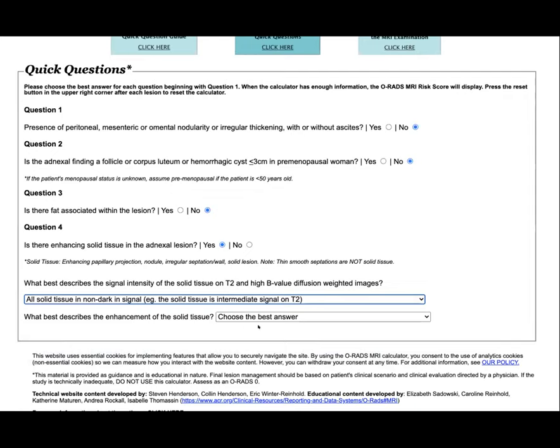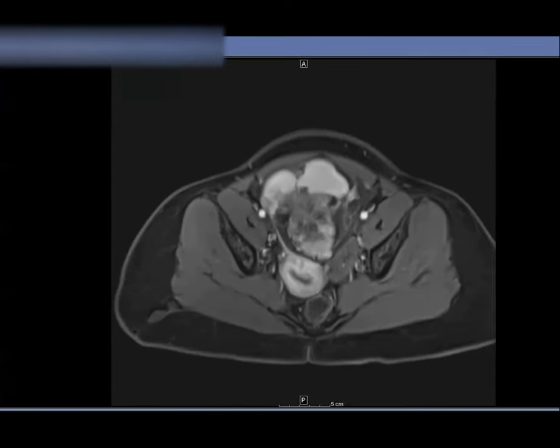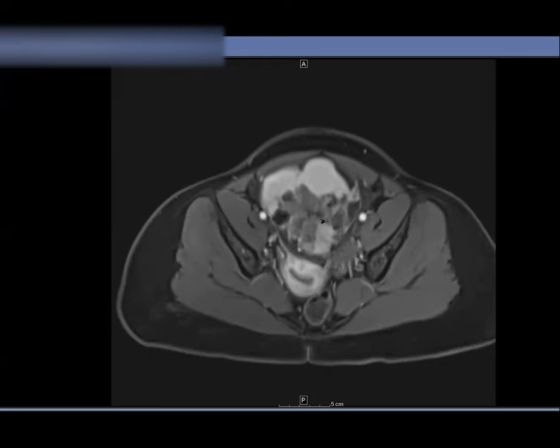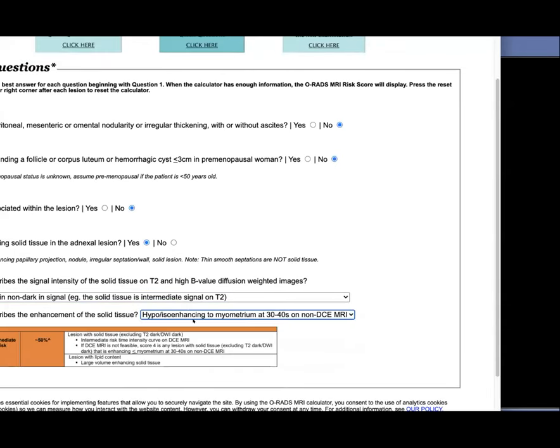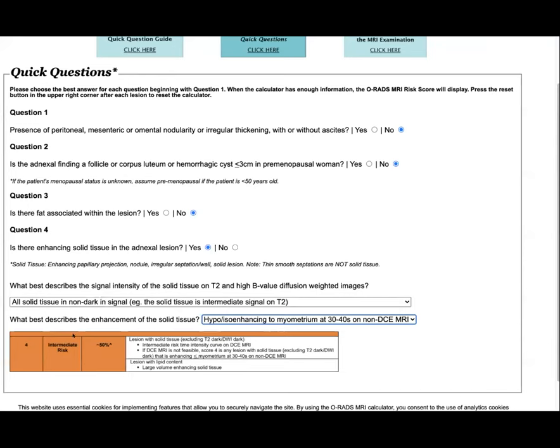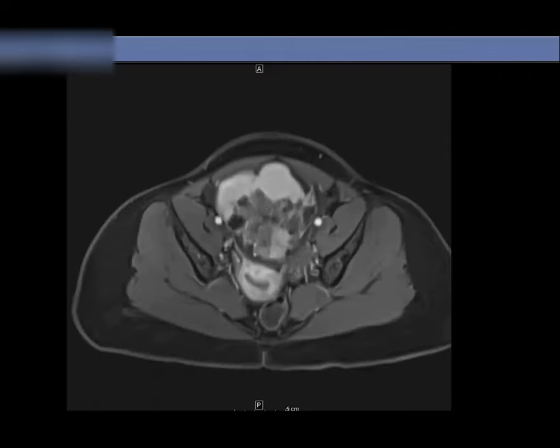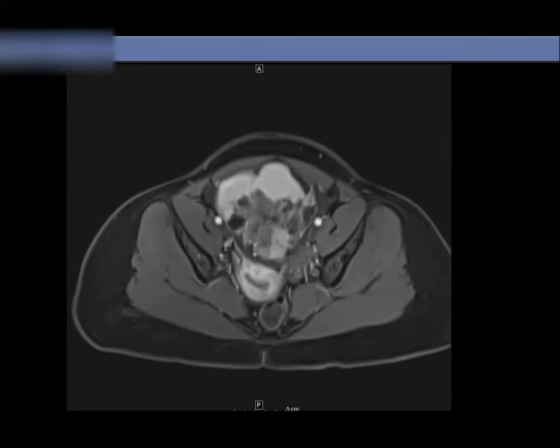The interesting part is: what is the best enhancement? If you don't do DCE, they ask for enhancement compared to the myometrium. In this case it's hypo-enhancing compared to the myometrium. When you put that in, hypo-enhancing, it ends up being an ORADS 4. I thought this was interesting because I thought this is definitely a solid cystic mass — it should be ORADS 5 — but in ORADS it's intermediate risk, 50% risk of malignancy. The fact that it's not enhancing more than the myometrium means it's not as high a risk as some other tumors. Any ORADS experts out there?